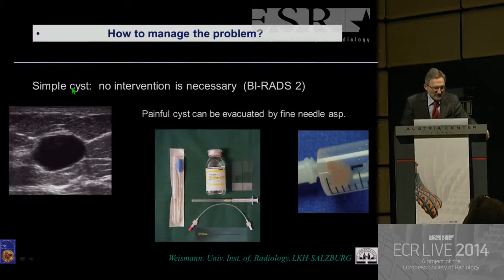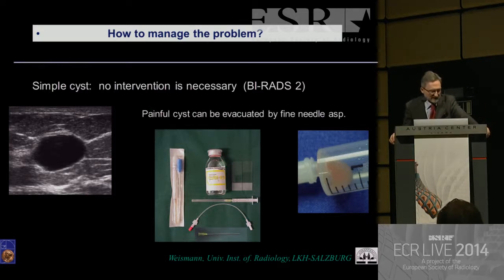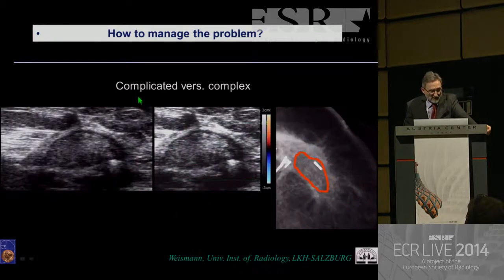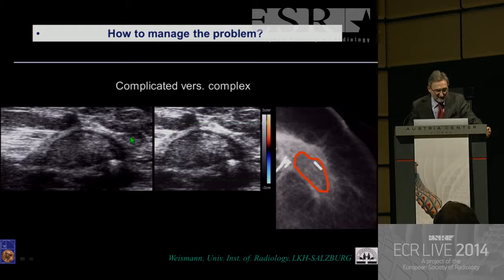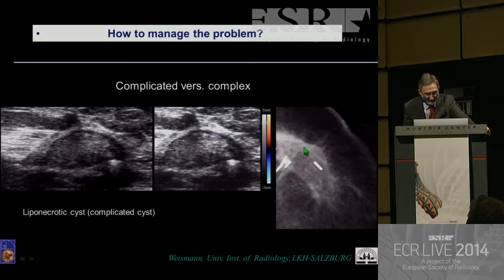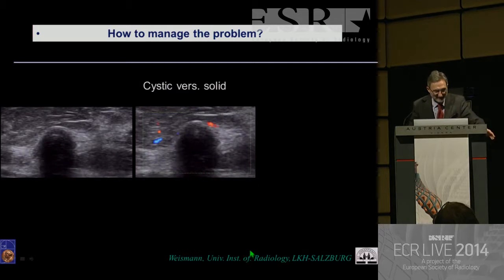How to manage the problem? A simple cyst usually needs no intervention. Only if a cyst is painful or big, you can go for evacuation by fine needle aspiration — a simple, quick procedure if necessary. For complicated versus complex: go for a mammogram. In this situation, you realize this is a liponecrotic oil cyst — a complicated cyst, no vessels inside, so no intervention needed.